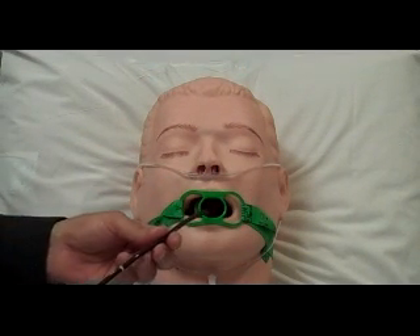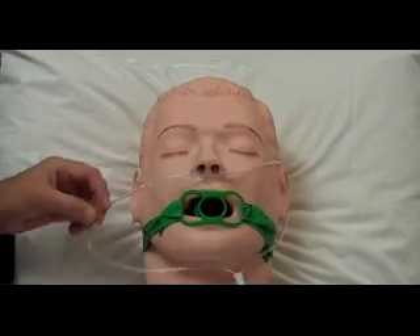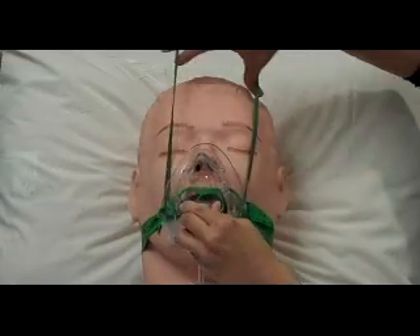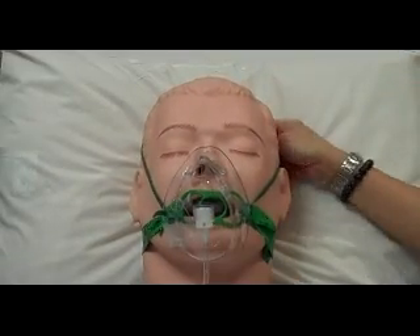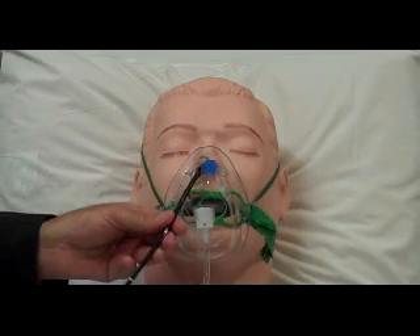When the bronchoscope is inserted through the mouth, the oxygen is provided using nasal cannula. On the other hand, when bronchoscopy is performed through the nostrils, a face mask is applied and the bronchoscope is inserted through the mask into the nostril.